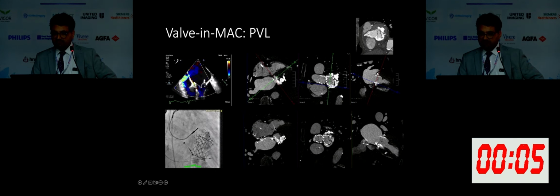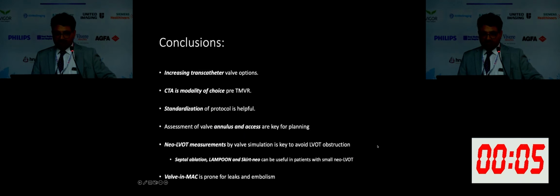You can see there is a contrast channel outside the device, which is continuous between the atrium and ventricle. Then this patient had a percutaneous procedure. This hole was plugged, and it took care of the leak. And you can see on follow-up CT the implantable device sealing this area of leak, also seen on this plane.